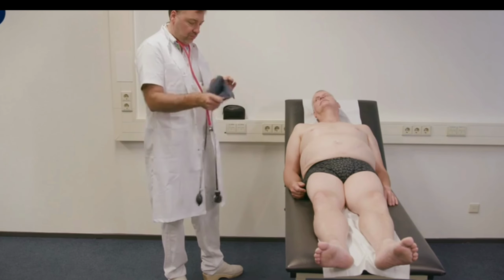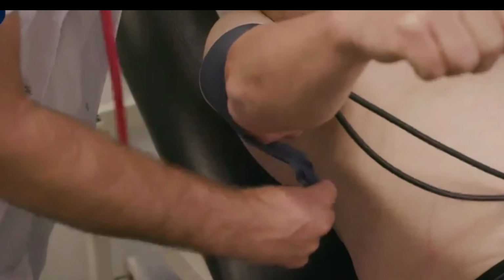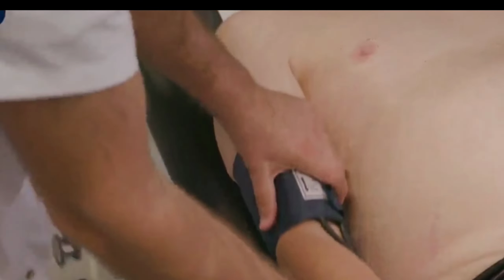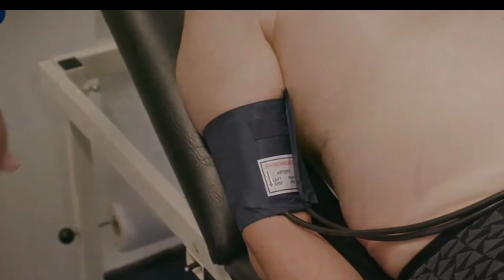Measurement of the arterial blood pressure over the brachial artery can be performed using a manual or automated sphygmomanometer, ensuring that the blood pressure cuff is the correct size for the patient's arm and that the marker of the cuff is lined up with the brachial artery.